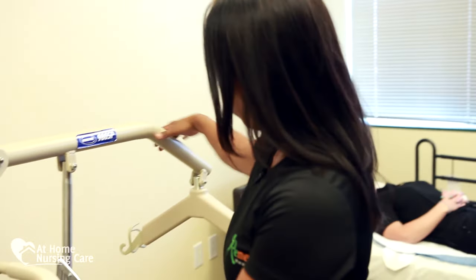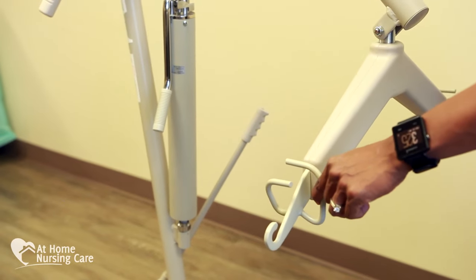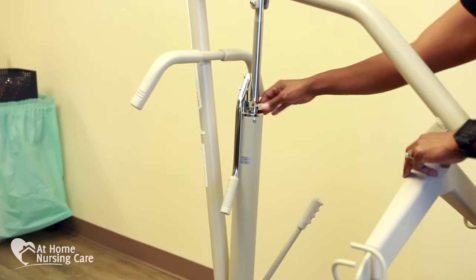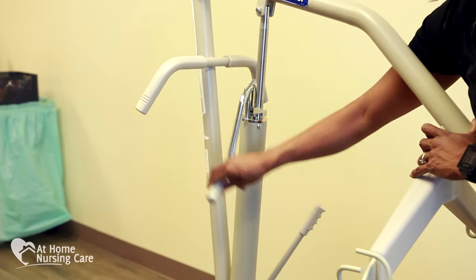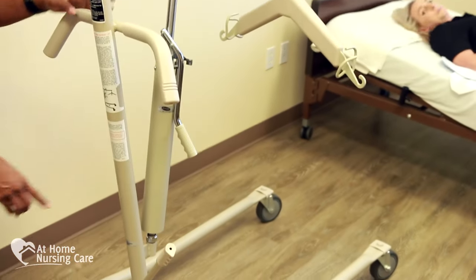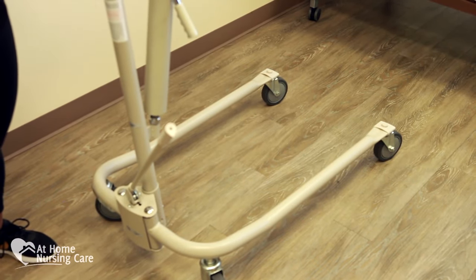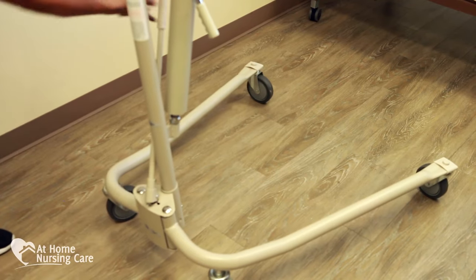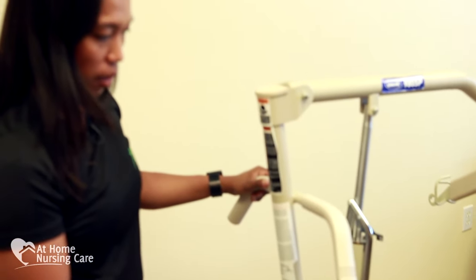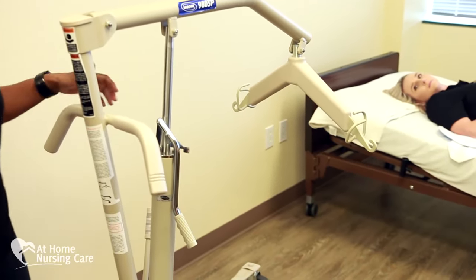With the Hoyer, we have the swivel bar, and the swivel bar has attachments for the sling — a front and back. The control valve will allow it to lower when moving counterclockwise, and clockwise will help you pump the Hoyer Lift to raise it up. For stability, there is a spreader bar. The spreader bar is currently at a narrow base, but when we have the client in the Hoyer Lift, we need to spread it open to create a good base of support. The Hoyer Lift also has wheel locks for additional stability, driver handles on the side, and the actual pump to raise it.